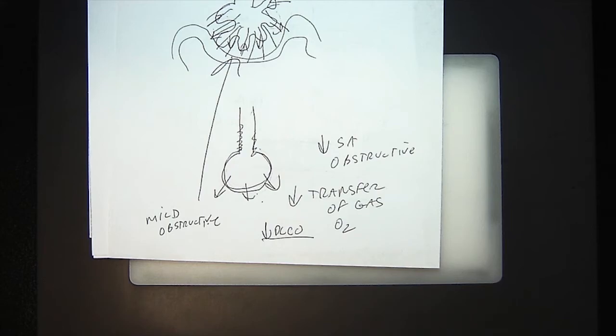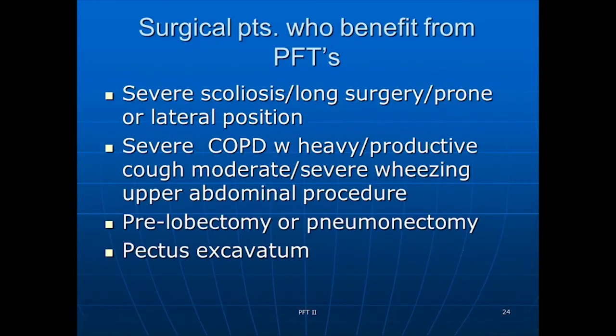So anybody that has severe COPD, even severe asthma, even though it's reversible, may benefit from pulmonary function studies. Patients that are going to have any kind of surgery that's going to impinge upon the thorax, the chest, pneumonectomies, lobectomy patients, these are the ones that are going to benefit.